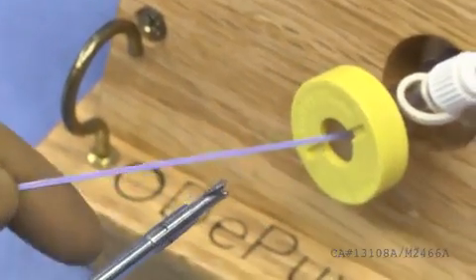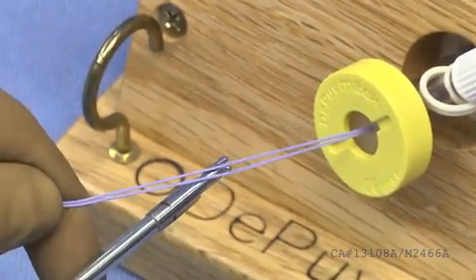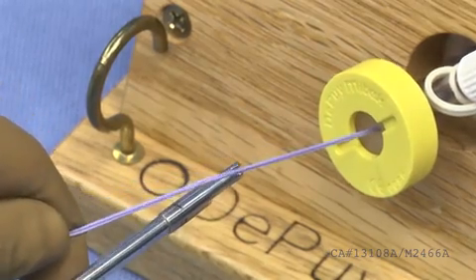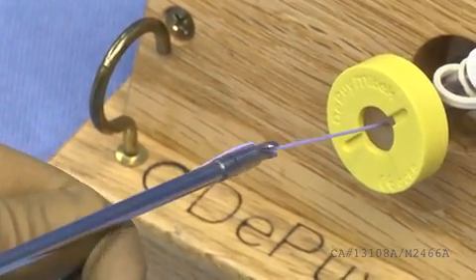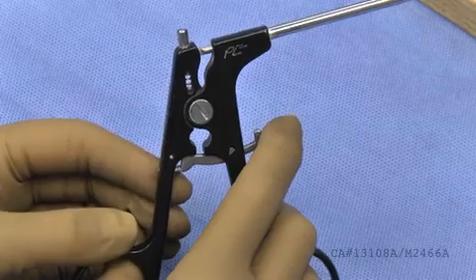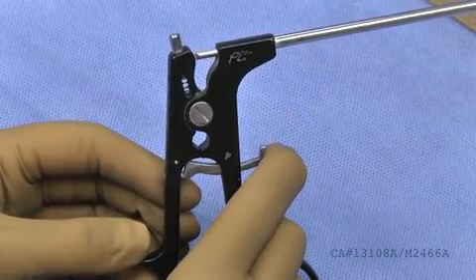The cord cutter is used to cut suture in arthroscopic procedures. Using the slotted distal end of the cutter, place your sutures through the slot, close the jaws of the cutter, zip line down to the knot, and finally pull the trigger to cut the suture above the knot.